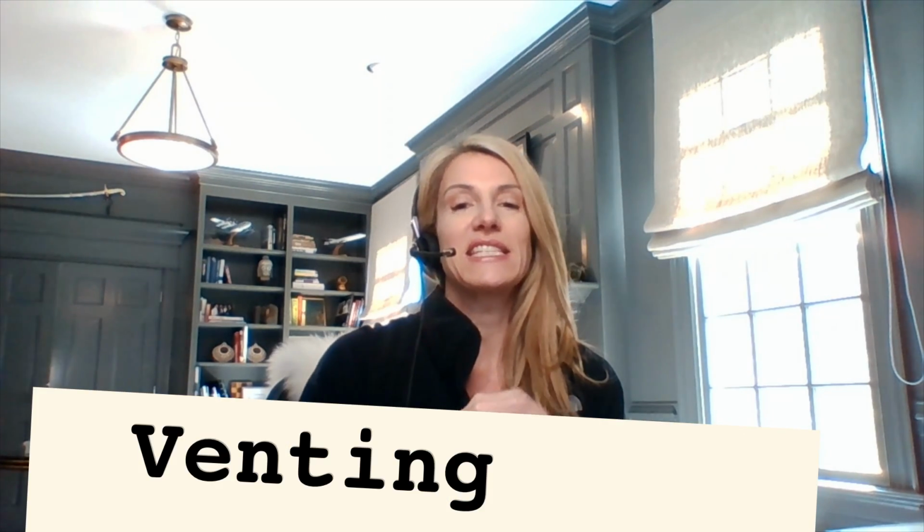Okay, so in the first video, we talked about comfort and making sure tube feeding is going well and developing a plan B when the feeding isn't going well. Now we'll get started on the second topic in this series, which is venting. Venting is one of those topics that I think is very underrated in terms of its usefulness. Venting can be an incredible tool, not only to keep your child comfortable during a feeding, but also to understand how your child is processing food and whether their food needs are changing.